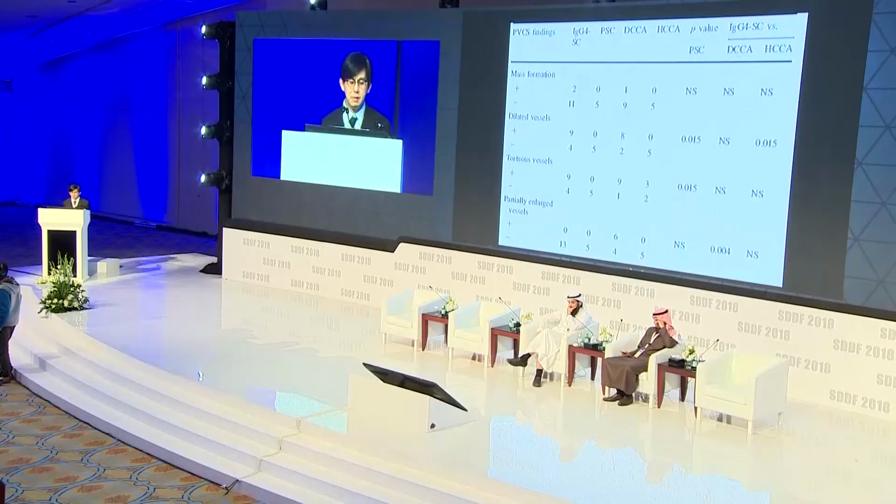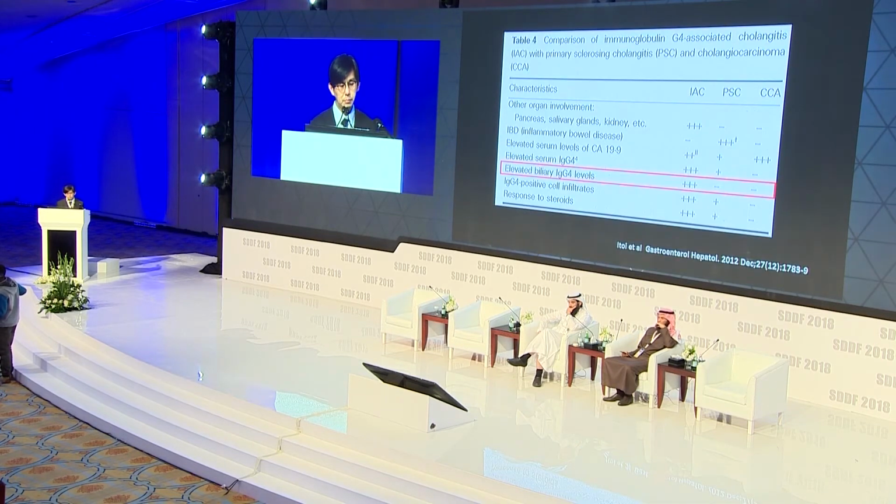Unfortunately, the SpyScope has been around for a short time, and we really do not have enough experience, and the nomenclature has yet to be validated. I think at the time being, we still could continue to rely on other features such as clinical features, and we continue to rely on the use of biopsy. And in the case of diagnosing IgG4 disease, we need biopsy and IgG4 staining and histology.